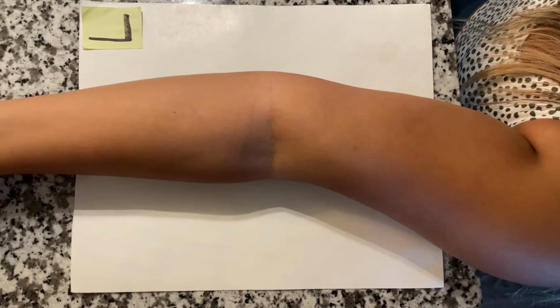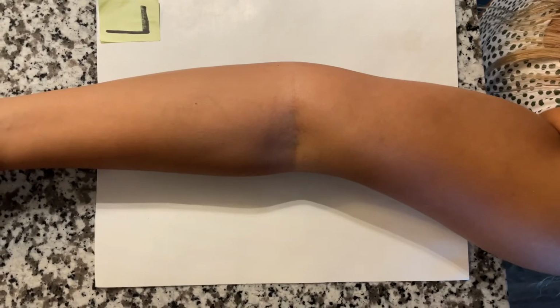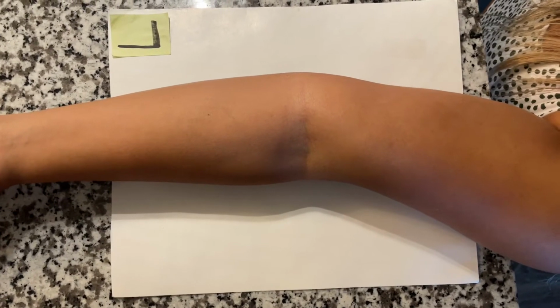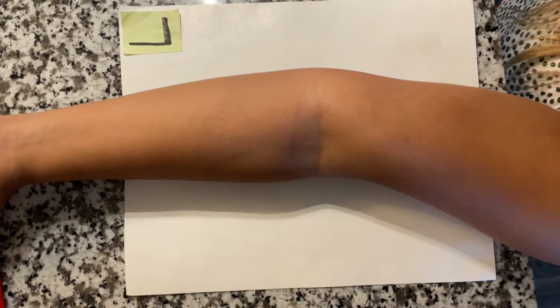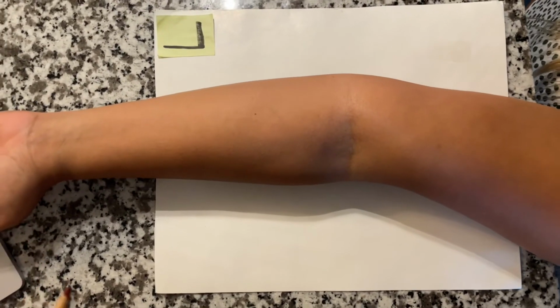Lateral oblique elbow. Extend the elbow and center it to the center of the film. Externally rotate the hand and arm so that a line through the humeral epicondyles forms a 40 to 45 degree angle with the film plane. The center ray will be perpendicular to the midpoint of the elbow, to the center of the film.